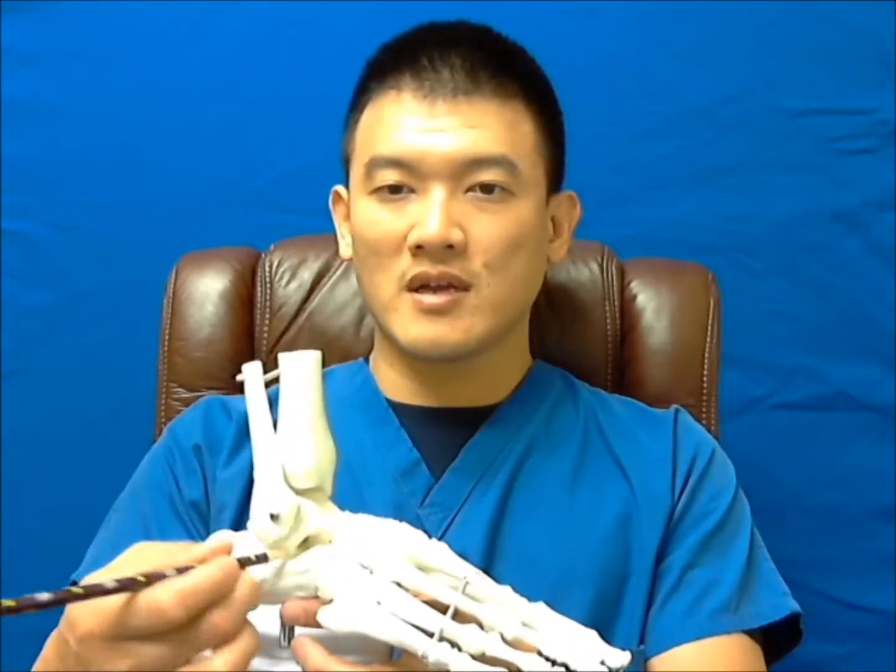This arthroscope was invented back in the 1970s in Tokyo, and it's been used significantly for the ankle. Orthopedists like to use it for the knee, shoulders, elbow, wrist, and even, for an experienced arthroscopist, mild disease in the subtalar joint can also be addressed. This is a very small joint and requires a very experienced arthroscopist to get in here and clean out the arthritis in that joint. That helps also. But for the foot and ankle, the ankle arthroscopy gives us the best benefit.